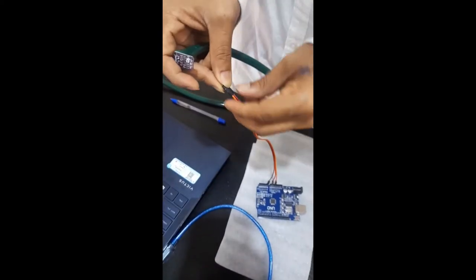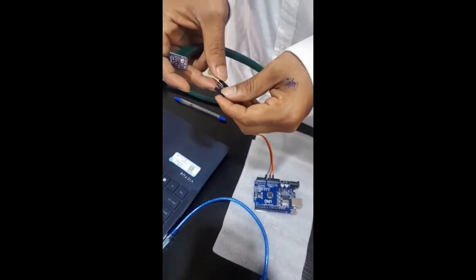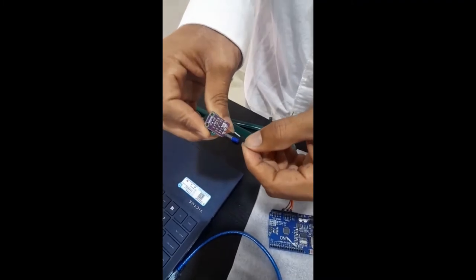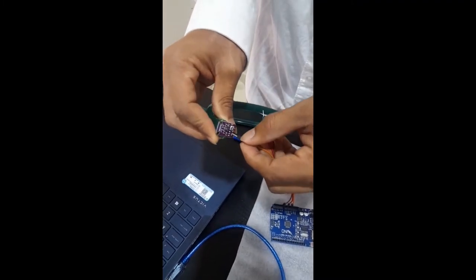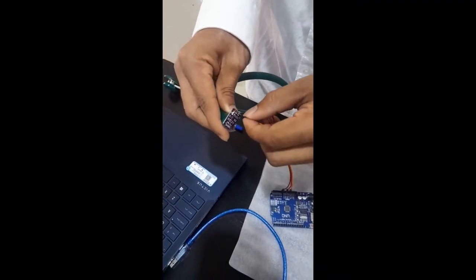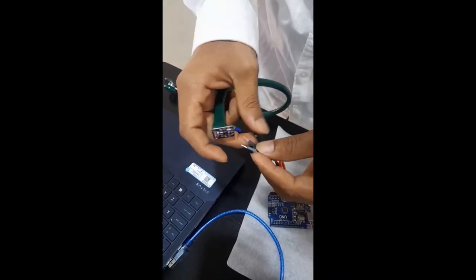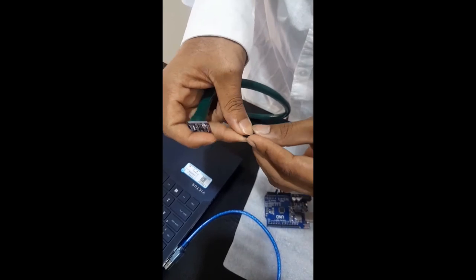As you see, the orange wire which is connected to the 5V power source is connected to the VCC, which is Voltage Common Collector of the microphone. The ground is connected to ground, and the output is connected to the analog pin A0.